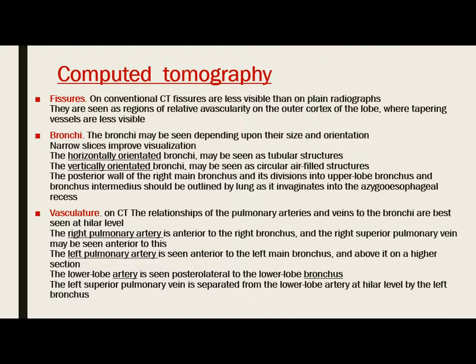The relationship of the pulmonary arteries and veins to the bronchi is best seen at a higher level. The right pulmonary artery is anterior to the right bronchus, and the right superior pulmonary vein may be seen anterior to this. The left pulmonary artery is seen anterior to the left main bronchus and above it on a higher section, so the pulmonary veins are anterior to the pulmonary arteries on both sides. The lower lobe artery is seen posterior lateral to the lower lobe bronchus. The left superior pulmonary vein is separated from the lower lobe artery at a higher level by the left bronchus.